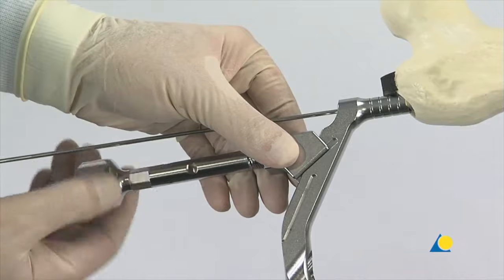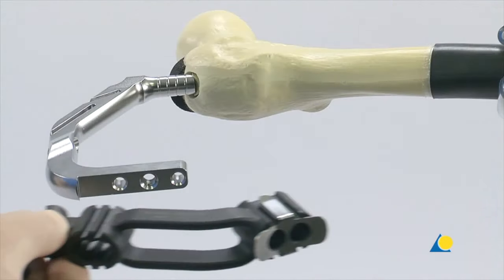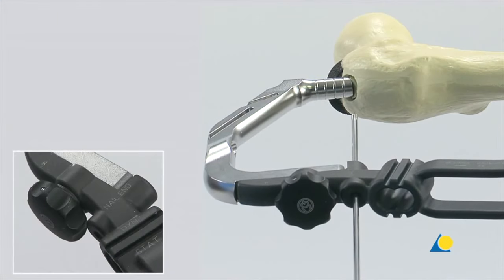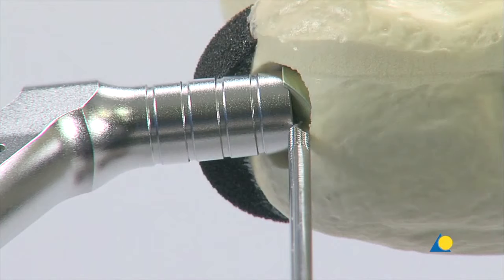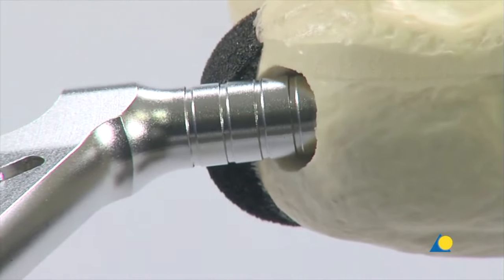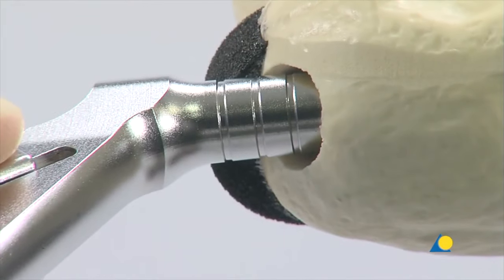After the nail has been inserted, the connector is removed along with the reaming rod. To check the proximal nail position, the aiming arm is attached to the insertion handle. A guide wire is then inserted to the bone through the hole marked nail end. The tip of the guide wire indicates the exact proximal position of the nail. The 5mm distance between the markings on the insertion handle corresponds to the extensions of the end caps. The final nail position must be verified under image intensification in the AP and lateral views. To adjust the depth of the nail, the connector is re-applied and with gentle hammer blows, the nail is further inserted until the required depth is reached.